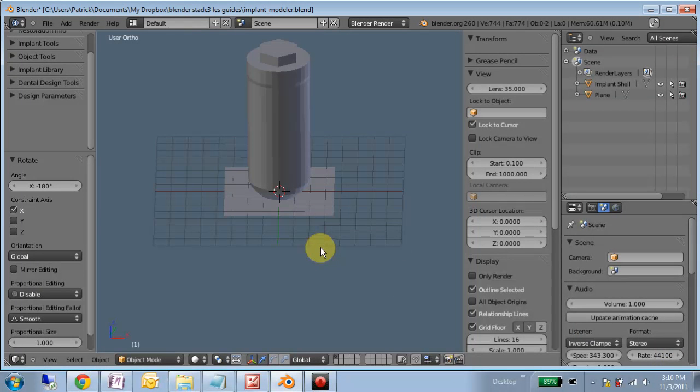Okay, this is part two of the implant modeling tutorial. This is where we're going to model a little bit more detailed anatomy and geometry. We're going to model the threads and then essentially complete this with a little bit more detailed version.